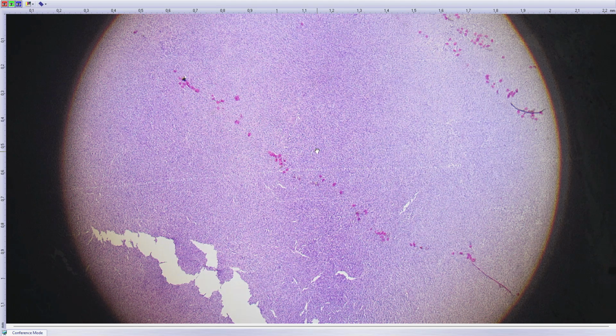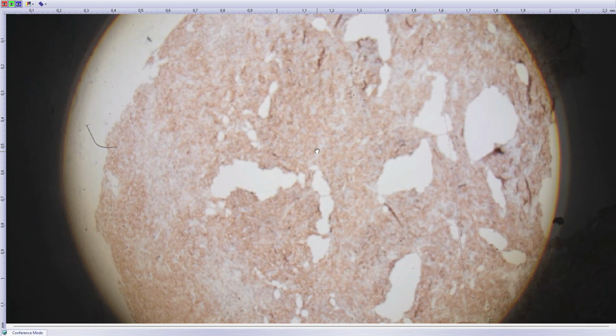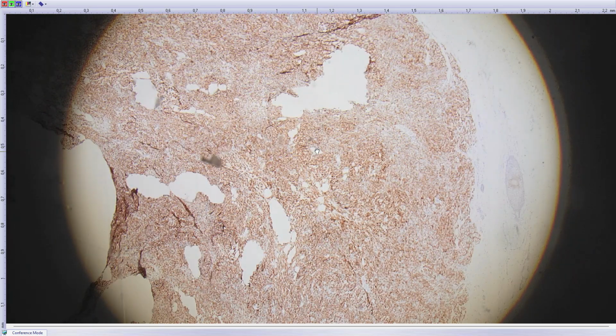Again, with this constellation of features, lower extremity, exophytic lesion based in the dermis, very well circumscribed, relatively small. There are a few differential diagnoses, but there is one number one differential. Any suggestions? It's S100 negative, SOX10 negative, definitely. Dermatofibroma, exactly, which one? Cellular. Yes, it's cellular, but it's also ALK positive. Epithelioid. Yes, so this is epithelioid fibrous histiocytoma.